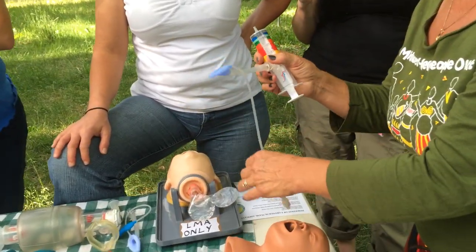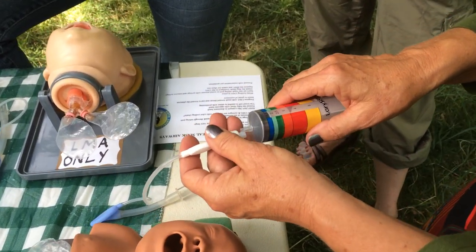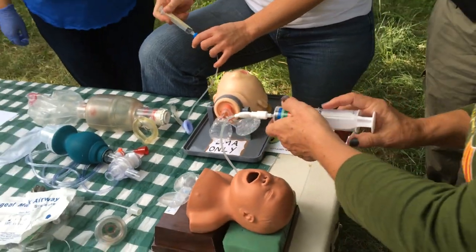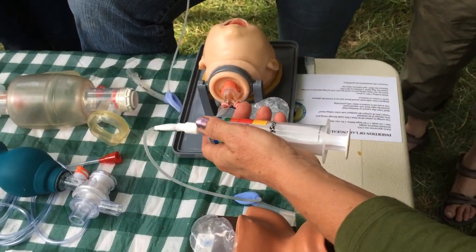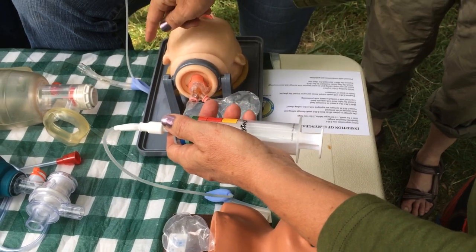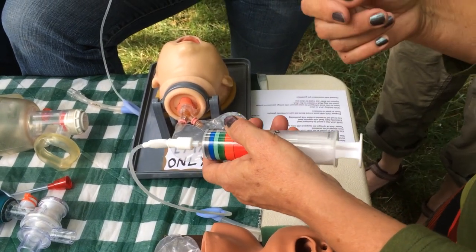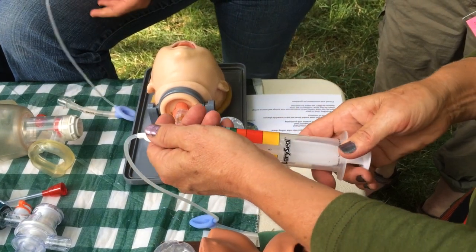So, the way you do this is you put your empty syringe on. If you want to pick up these and do it as I'm doing it, you're welcome to. Okay, so you have your syringe empty, remember? Fill it up. I'm just saying do it step by step and that way we'll be doing it together, and I can point out some features, okay?